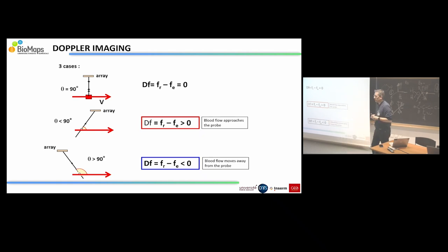Mark? You mentioned that the blood cell is making the scattering, or can you image just the liquid flows? Or is it really that the ultrasound is coming from the actual cells? Echoes are coming from all the scatterers of tissues.